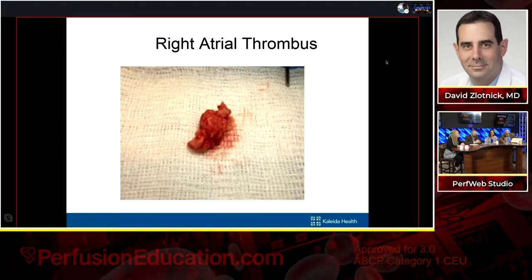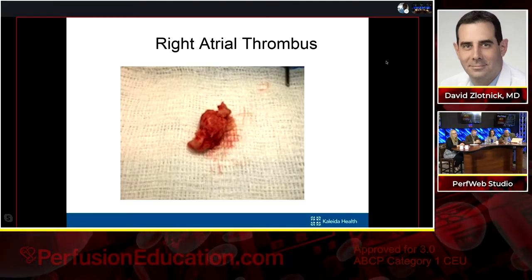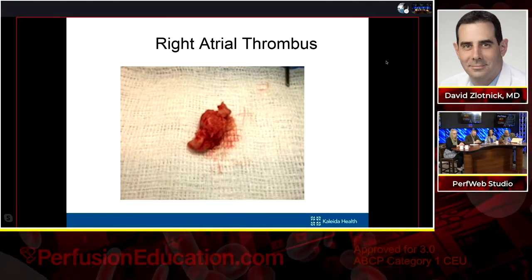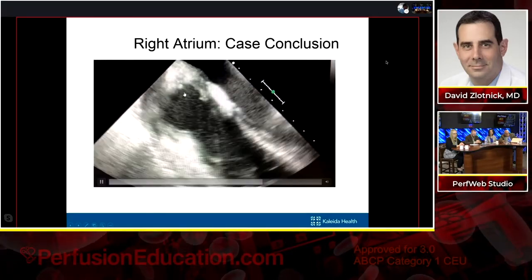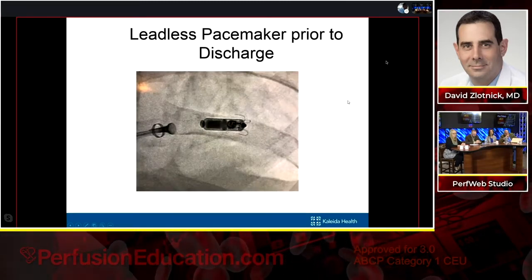Yeah. Now the next slide is going to show the post procedure TEE, which will still show kind of a shaggy vegetation material that's attached to the wall around the right atrium without a large vegetation. Yeah, I see it. She's pointing to it. Yeah. So that we thought was acceptable, and we treated him with antibiotics.